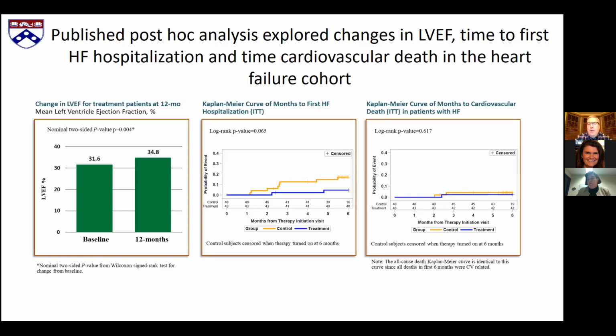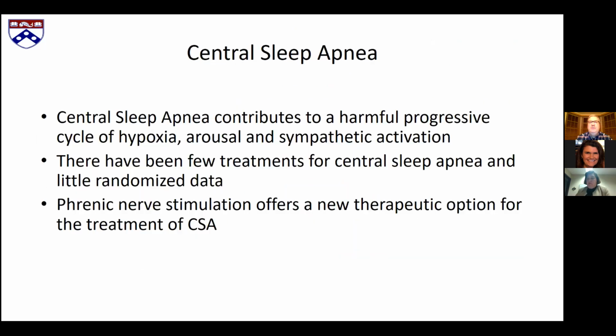You know, I will say that we did a trial in obstructive sleep apnea and heart failure patients in the hospital, and showed that those patients that we treated, very similar results, were much less likely to be readmitted. And that really triggered our hospital administrators, who are worried about their 30 and now 90-day readmission rates, to invest a little bit in the inpatient sleep program to help us get these patients screened, and then on the way out the door treated with an auto-titrating device to treat their obstructive apnea. I wonder if there's not going to be a similar call for central apnea, that really treating it will drive heart failure outcomes and be beneficial to treat aggressively.